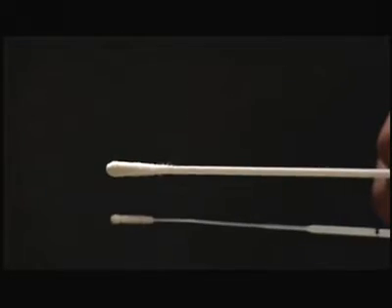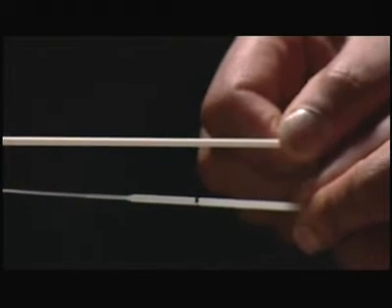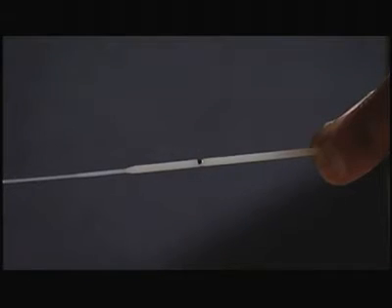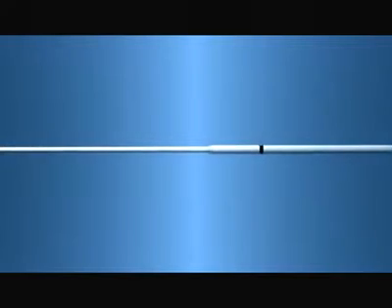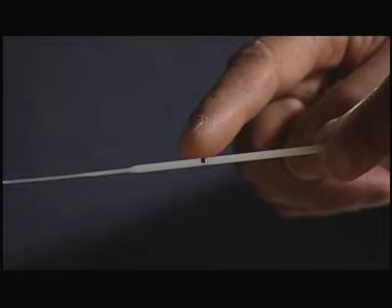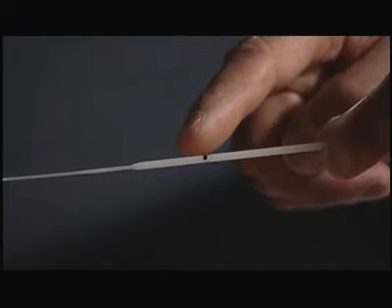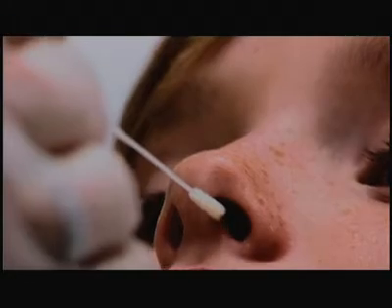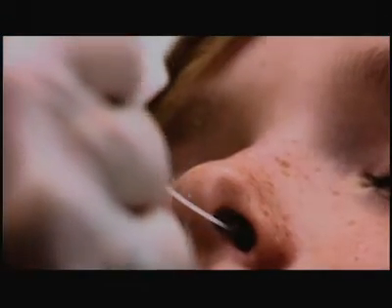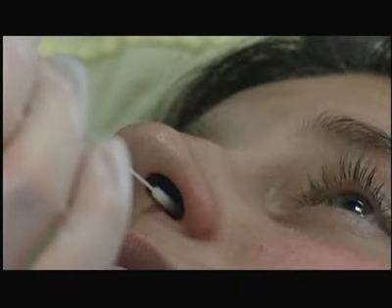Do not confuse this nasopharyngeal swab with a throat swab, which is shown here for comparison. On the thick part of the swab is a score line or groove, shown here, which facilitates break-off of the swab into the collection tube once the sample has been taken. Unless you are unduly vigorous during the swabbing process, the swab will not break off at this point.